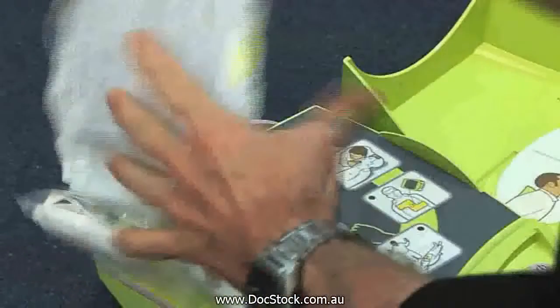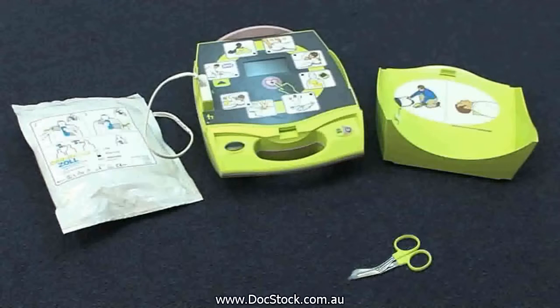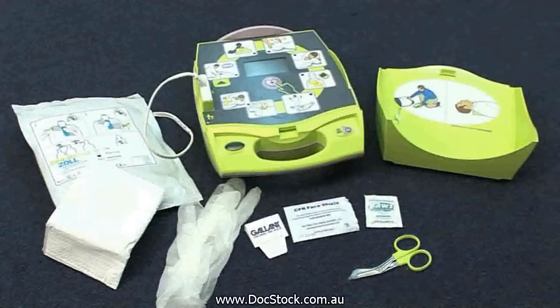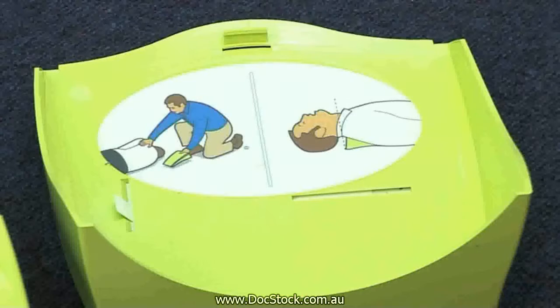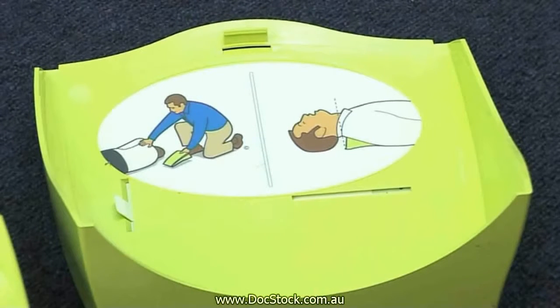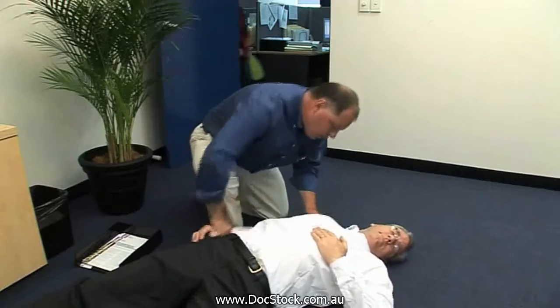Remove the lid of the unit by pressing up at the front. Inside the case you will find scissors, an antiseptic wipe, gloves, a razor, a towel, a face shield, and the electrode pads. The lid can be used under the patient's shoulders to tilt the head back. Do not use the lid if there is a suspected head or neck injury.